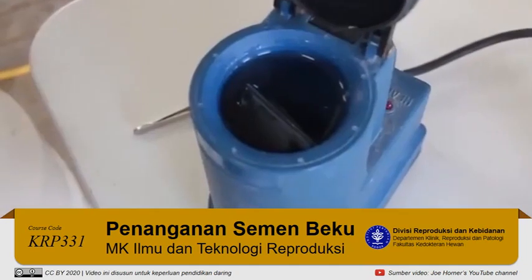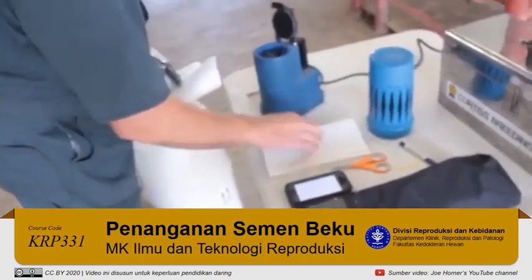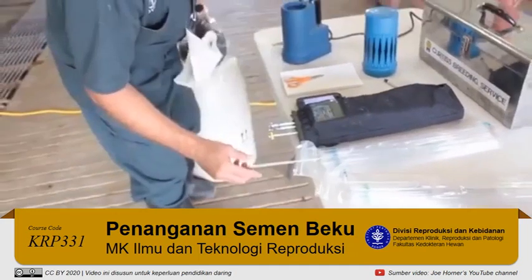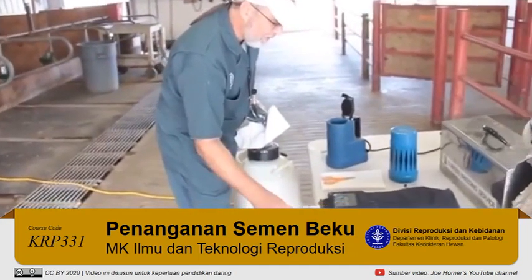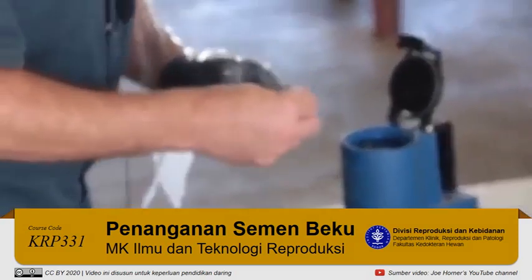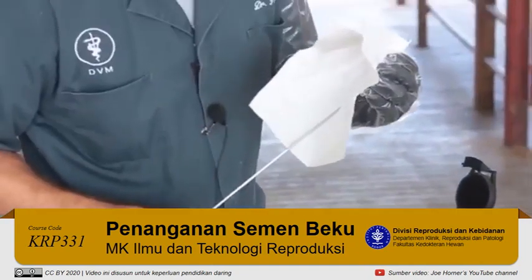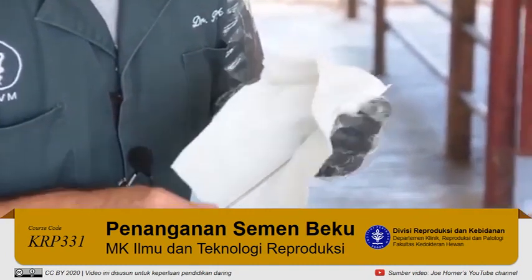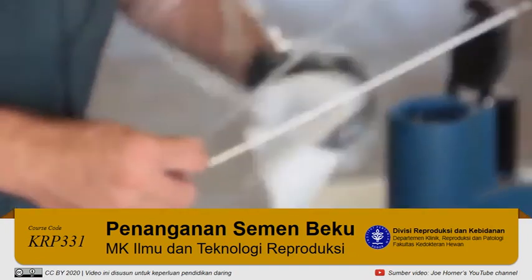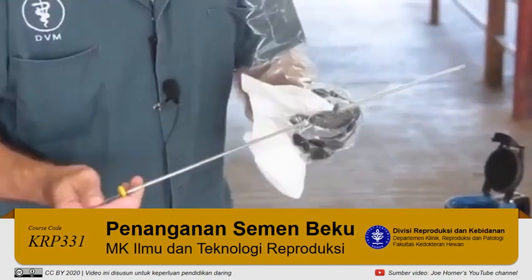During those 45 seconds, I can get my sleeve on so I'm ready to breed the cow. I have my paper towel ready to dry it off, scissors ready, and a sheath ready. I'll be using my yellow gun. After 45 seconds, I take the unit of semen out, put it in a paper towel and dry it off, then load the gun and clip the end of the straw. Then I load it onto the sheath, push it on, and it's set — I'm ready.